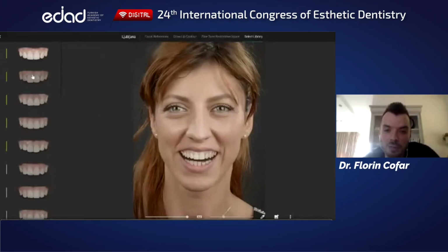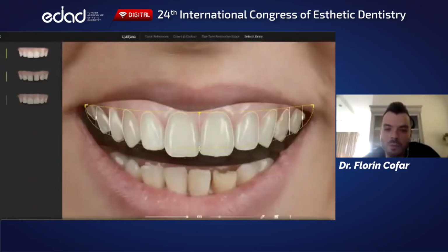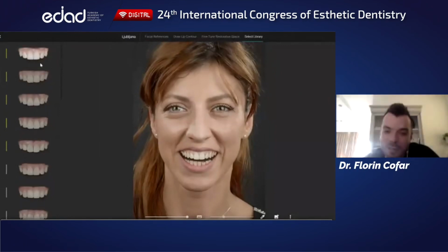design where you can just go in, select shapes, move things around, take decisions, and everything is reactive to what you do. So the difference to most software is that instead of me spending time to do these things, at every step of the software I'm working on a draft which is already there, and I can just alter things. Also, the nice part working this way: at the end of the design process, you usually have one design, one mock-up, one version prepared for that patient.